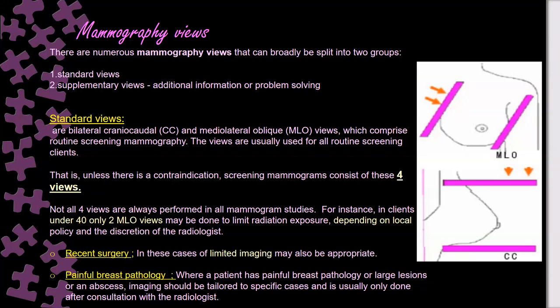I think if the patient has a lesion which is painful with mammography. Excellent, yes. Depending on local policy, less than 40 or less than 35, young ladies, they might do limited views sometimes. Or a follow-up mammography, less than 6 months follow-up, you might select some views and not perform all of them. It depends on the local policies. And screening of young ladies also, you might select some views.